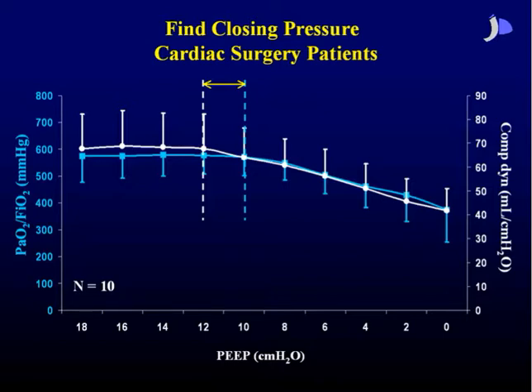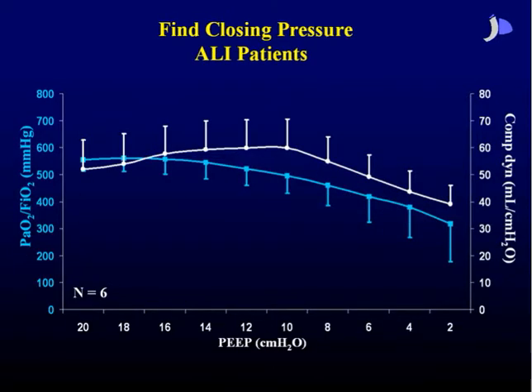So things are much different in acute lung injury patients. We're talking here about diseased lungs, very heterogeneous lesions. So lung mechanics is a more tricky parameter. Even though oxygenation was an early indicator, what we could detect in these patients is this maximum compliance point and the decrease. So at least we find a compromise, and we know that every PEEP level below this is way too low, because here we know that the lung is actively collapsing.